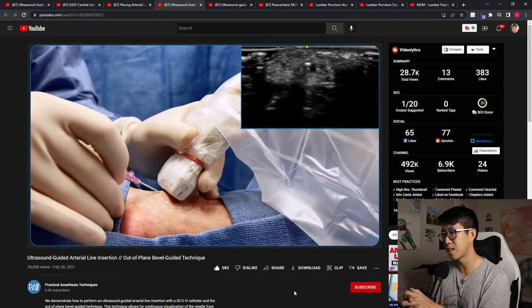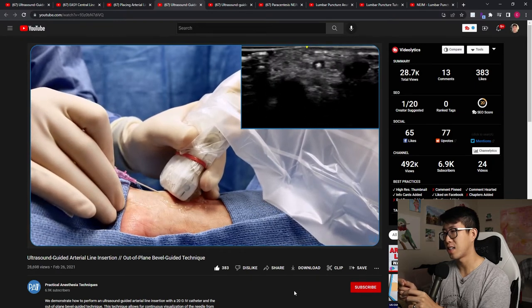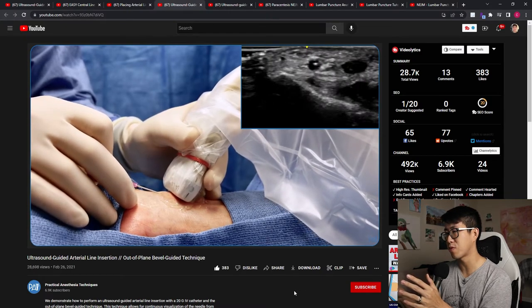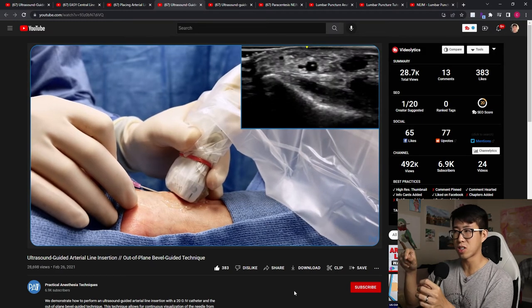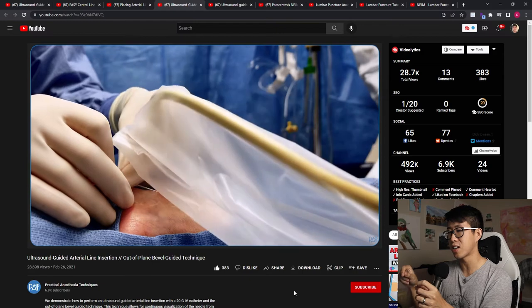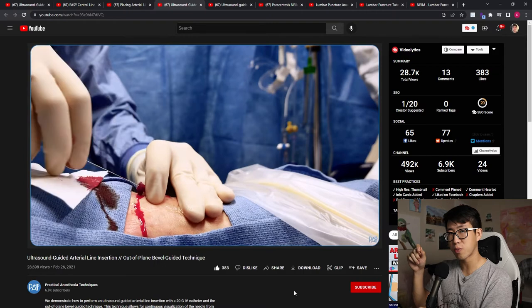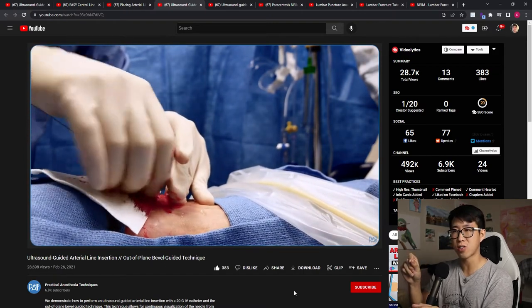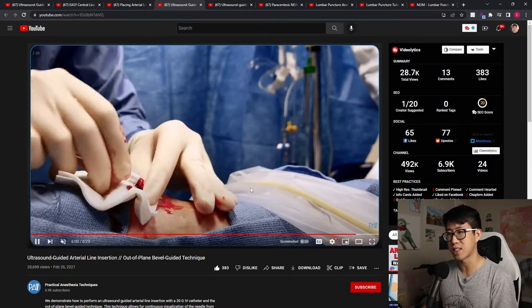You can see the tip was a little bit medial and then they redirected it until it was over the artery and then advanced it. Once they got the bullseye sign they moved their probe away until the tip disappeared and then advanced it further to make sure they're in the artery. For A-lines, you really want to make sure it's solidly inside the artery - don't just get flash and immediately start threading. I've had so much more success when I've actually visualized the needle going into the artery and advanced it several steps more before advancing the catheter.